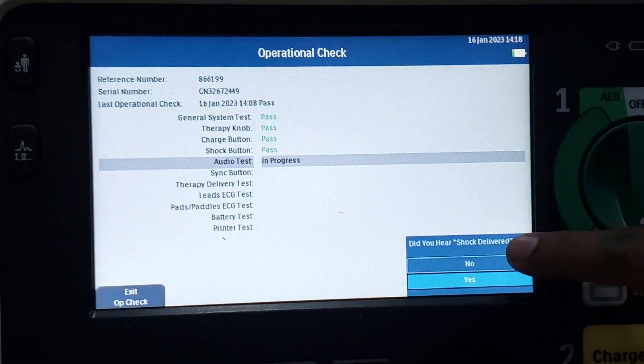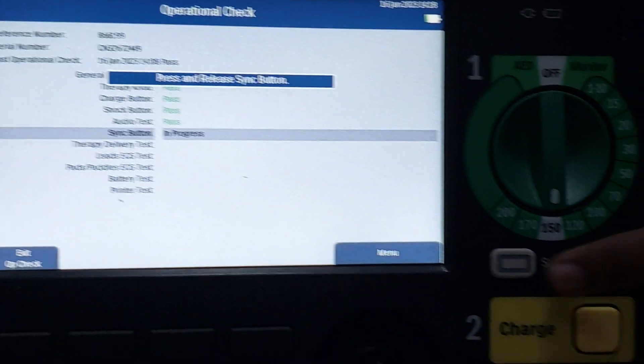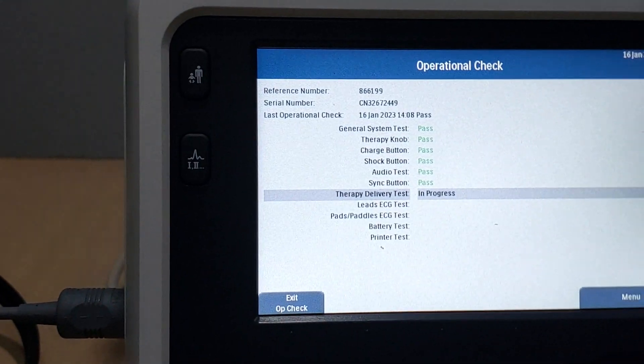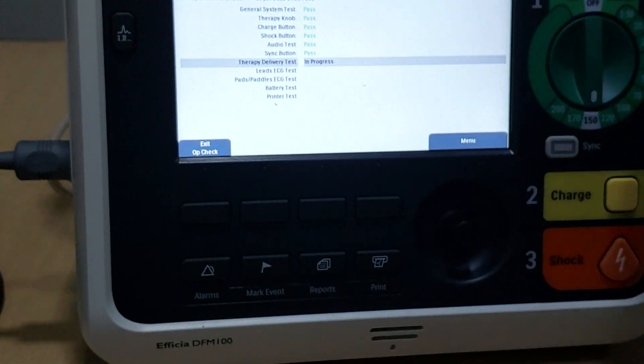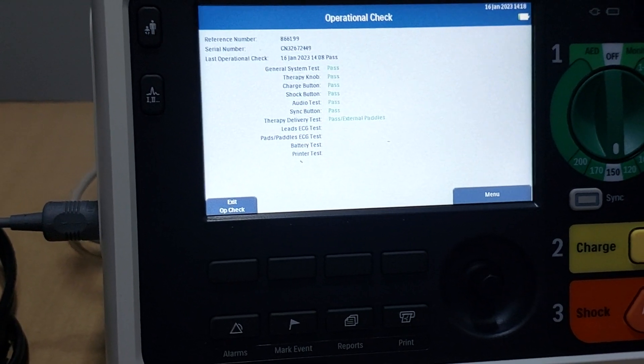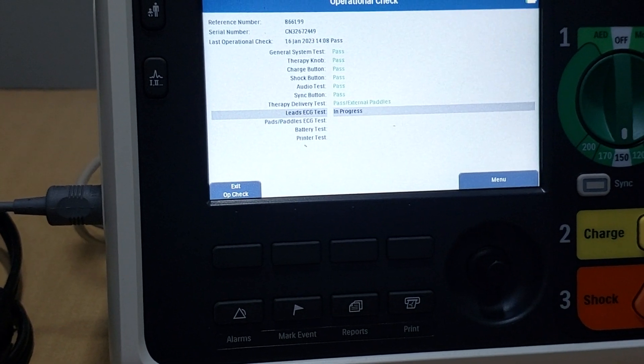You will hear a shock delivered sound — the shock is delivered. Now you can observe and listen to the shock delivered sound. Next, press and release the synchronous button, then press it again. You just have to follow each instruction displayed on the monitor. Everything will show as Pass in green — that means the machine is working.